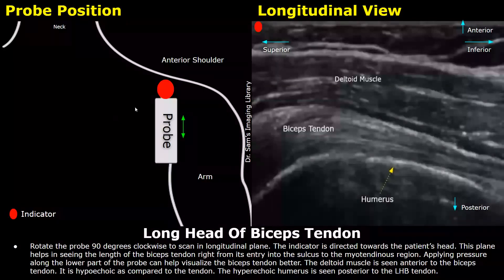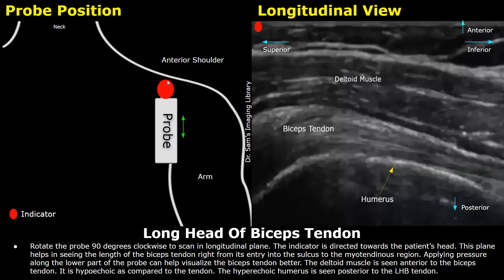Rotate the probe 90 degrees clockwise from the previous position to scan in longitudinal view. In the longitudinal view, the indicator is directed towards the patient's head. This plane helps us see the length of the biceps tendon from its entry into the sulcus to the myotendinous region. You can apply pressure to the lower part of the probe to help visualize the tendon better and keep the probe approximately perpendicular to the tendon.